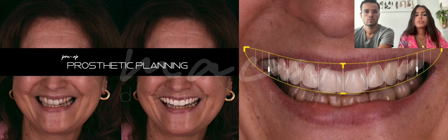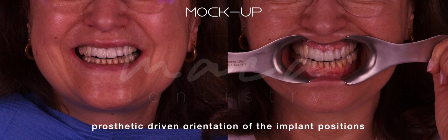I managed to create space for the right lateral incisor that was missing. I sent this 2D smile simulation to the lab and asked for the 3D mockup. Here you can see the photos of the patient with the mockup. The patient was very happy with the new appearance of her smile, especially regarding the right lateral incisor that she never had before. The mockup was approved and used to plan the implants.